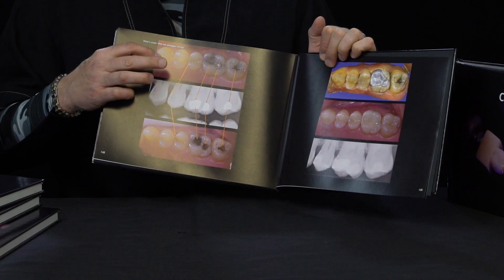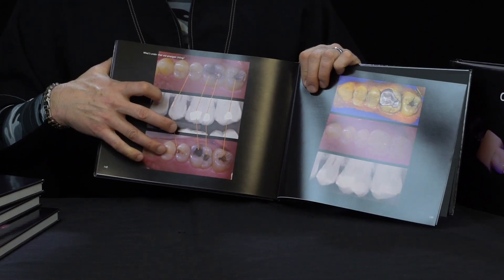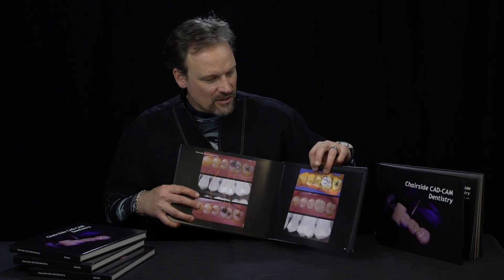A quadrant of amalgams — they look okay, the x-ray doesn't look too bad — and then what it looks like underneath those amalgams: you can see all of the leakage, the recurrent caries, the yuck underneath it, and it tells the story really well. On the next page is basically the digital story on how it's restored and what it looks like on the final x-ray. It doesn't take much to see what's going on, and there are two cases like that in the very back.